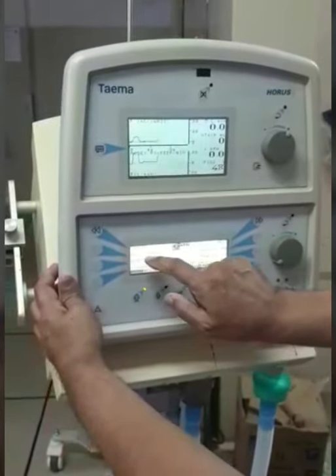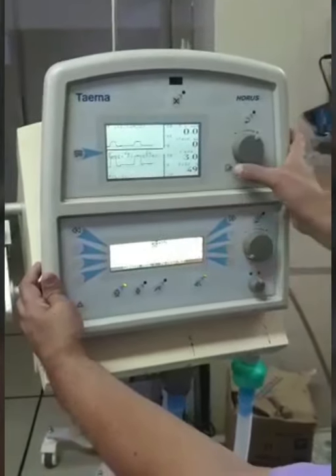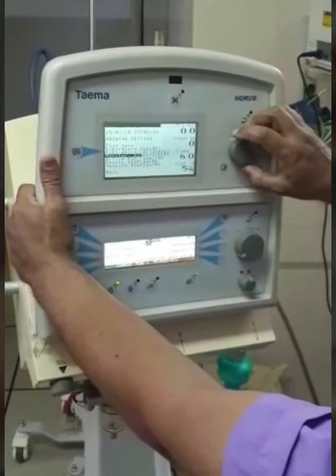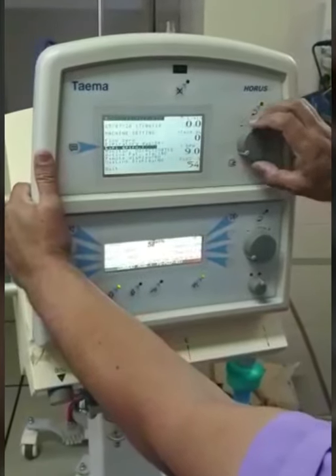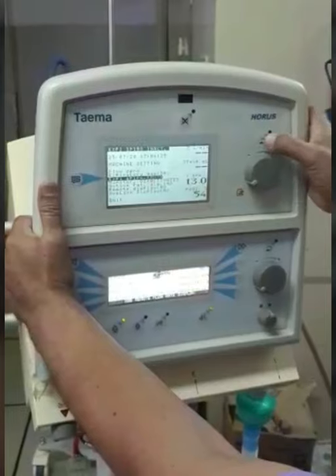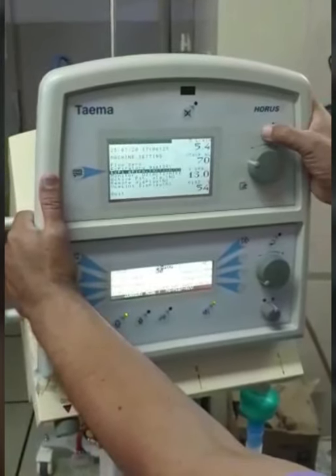I have kept a pressure support of 15, PEEP of 5, and respiration rate at 12. Now, in the machine, if you have the option to go to the machine settings and switch off the expiratory spirometer, please do it, so that the frequent alarm in case of minimal leak is avoided. If you have the option to mute it, please mute it.